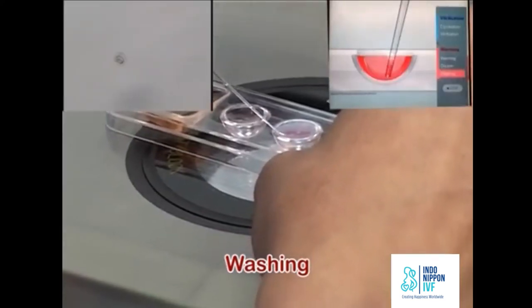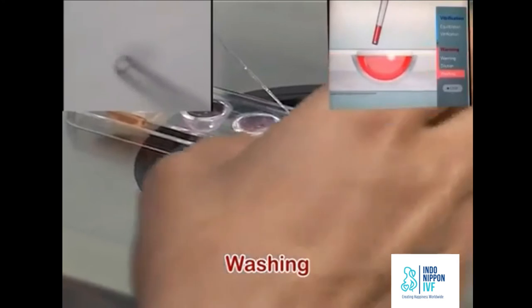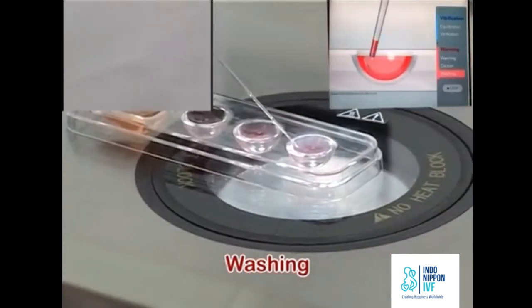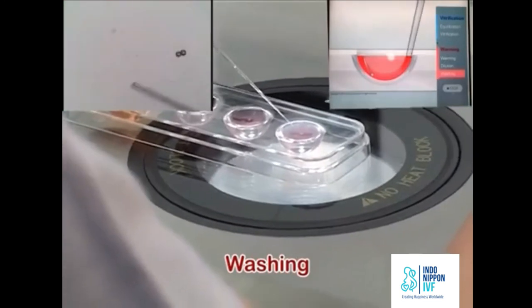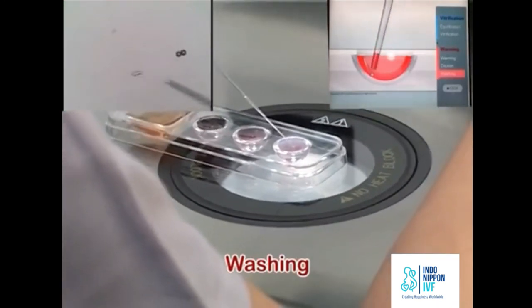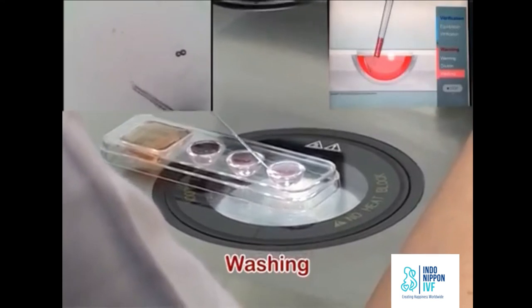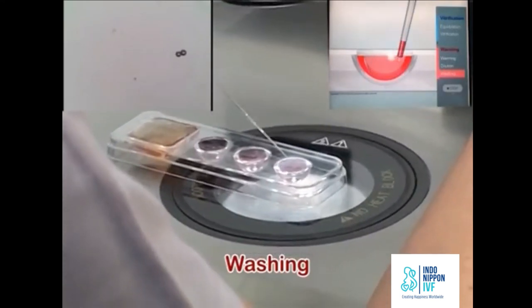Aspirate the oocyte with minimum volume of WS1. Put the oocyte on the surface of the WS2 well. It will free fall to the bottom of the well. Pick up the oocyte from the bottom and let it again free fall from the surface of WS2 well to the bottom, thus washing the oocyte twice.